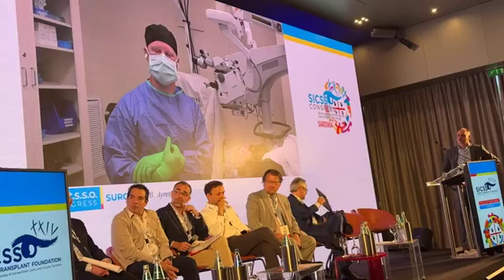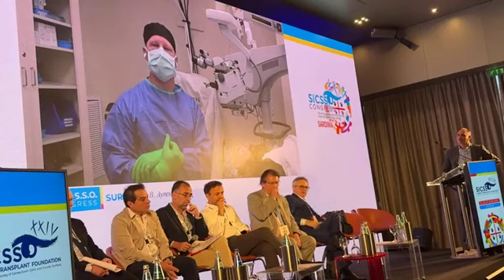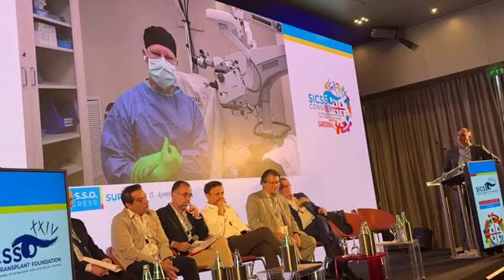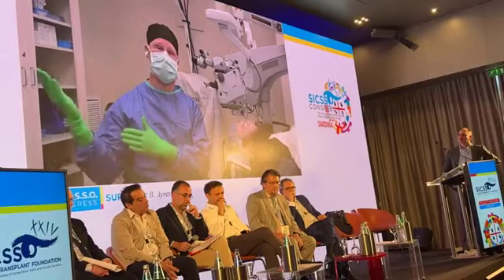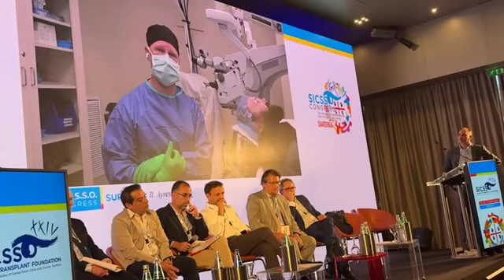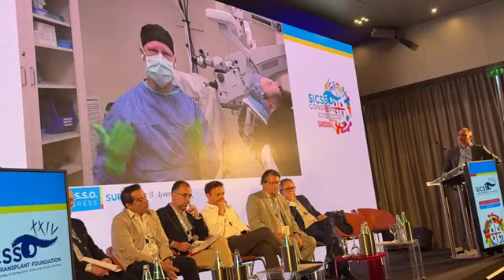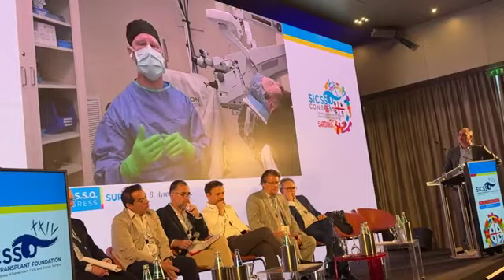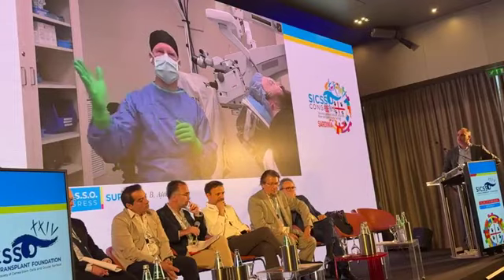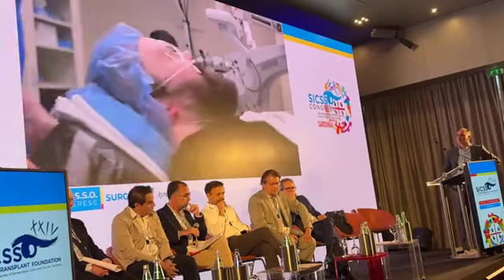Fascinating stuff. Just curious, did you create the tunnels earlier today or on a previous day? So I created the tunnels about 15-20 minutes before the live stream, and that's just because we have the laser right here outside the surgery center. But you can make the CTAC channels a day or even a week prior to the surgery. You can make those channels up to a week, maybe even more, before the surgery.